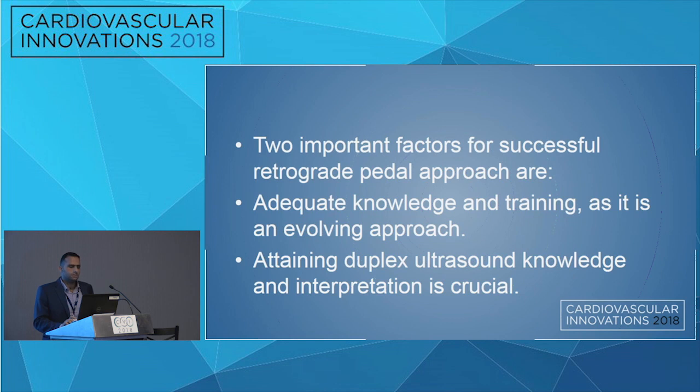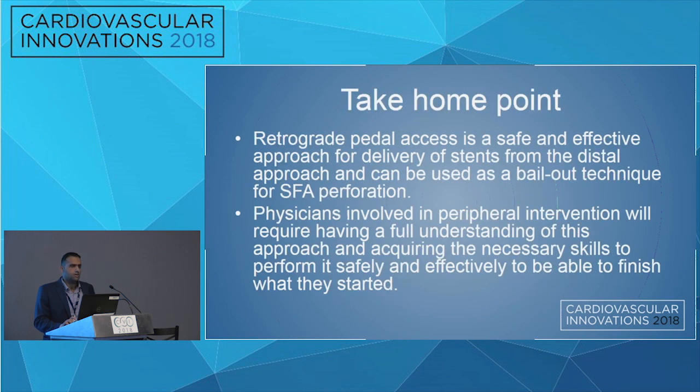Two important factors for a successful retrograde pedal approach are adequate knowledge and training, as it is an evolving approach, and attaining duplex ultrasound knowledge and interpretation is crucial. As a take-home point, retrograde pedal access is a safe and effective approach for delivery of stents from a distal approach and can be used as a bailout technique for SFA perforation. Physicians involved in peripheral intervention will require a full understanding of this approach and the necessary skills to perform it safely and effectively, to be able to finish what they started. Thank you.